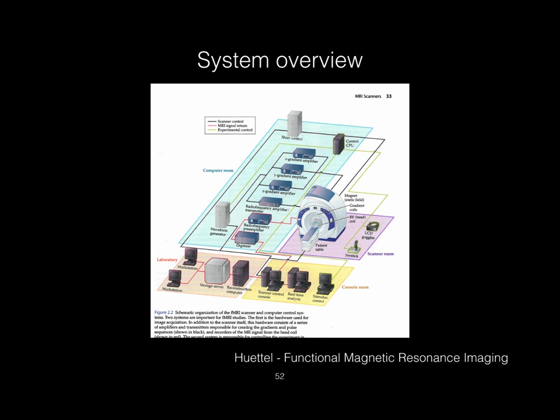And this is where our resonance comes in. And then we have spatial encoding using the gradient systems. That gives us our 2D and 3D localization of our signal. And all of these things can be modulated with exquisite precision with control systems that will let you bring out different contrasts in tissues and samples.